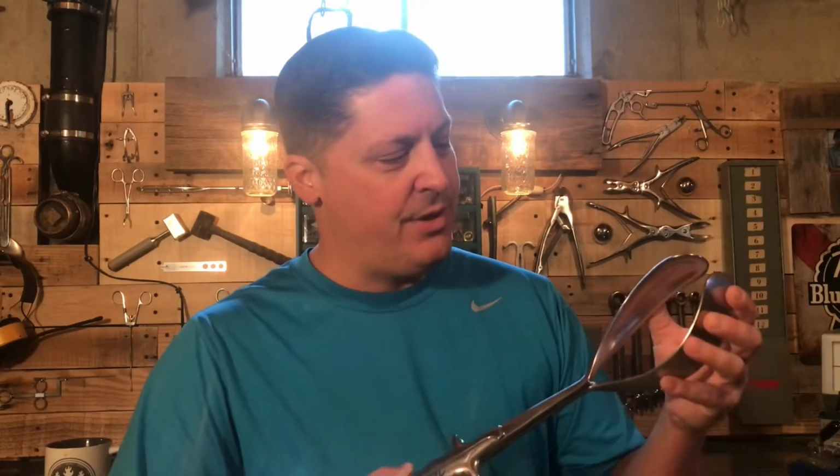So what I have here is a Tucker McLean delivery forceps. Now there's many varieties of delivery forceps. This is just one of them. So throughout the video we'll explain how these work, and I'll demonstrate on one of my daughter's dolls how they go around the baby's head to assist with delivery.